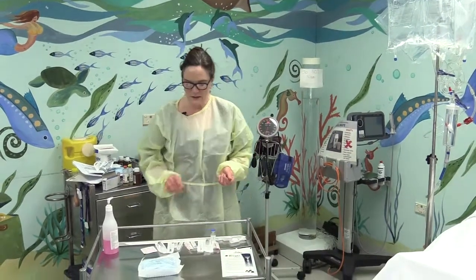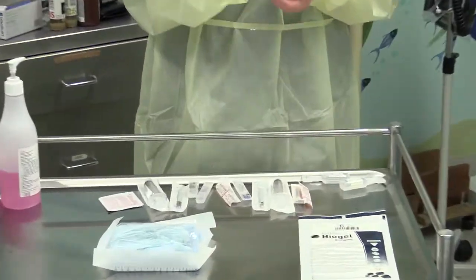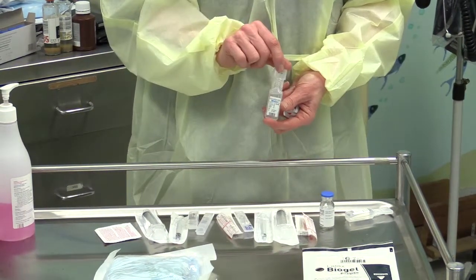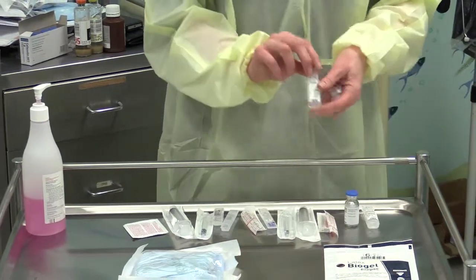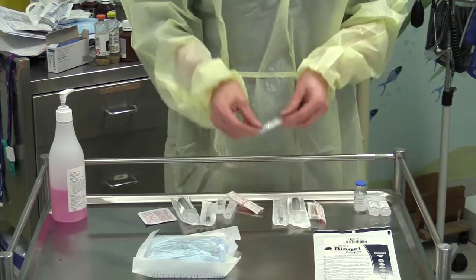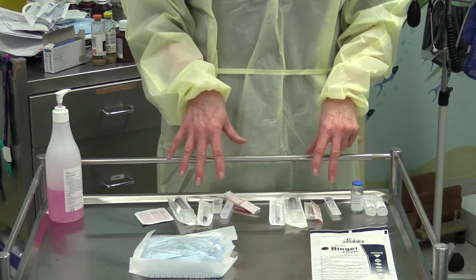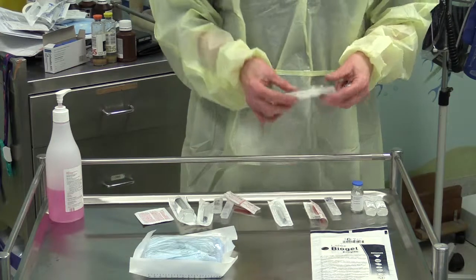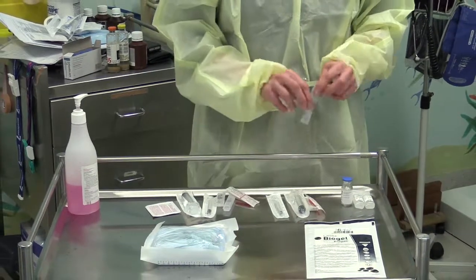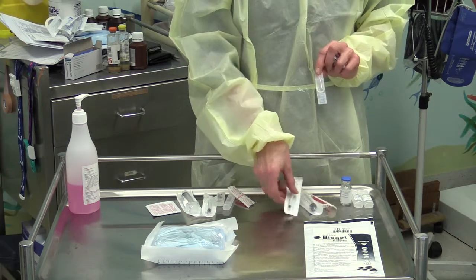The equipment that we need is a dressing pack, a pair of sterile gloves, cefazolin, some water for injection for mixing it, some normal saline to reconstitute it, a vial of gentamicin, needles and syringes of appropriate sizes. So generally we use a 10 ml syringe to make up the cefazolin, and depending on your dose of gentamicin, if it's a very small child you will need a 1 ml syringe to get the accurate dose, or a 2 ml syringe.